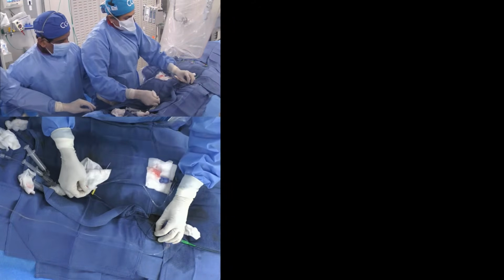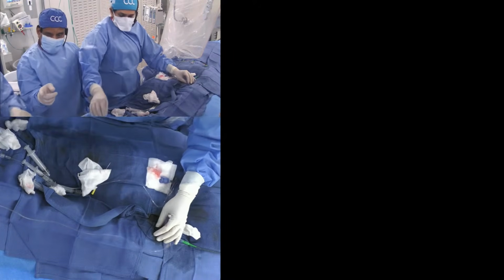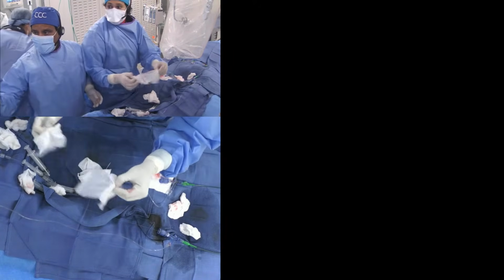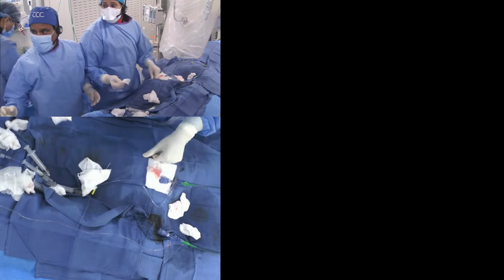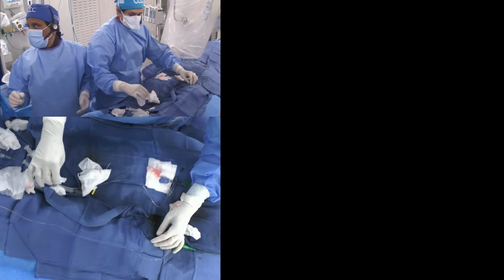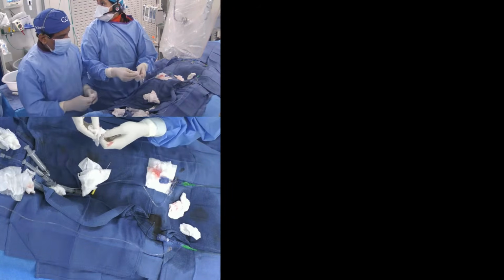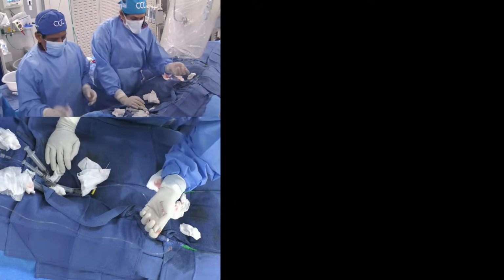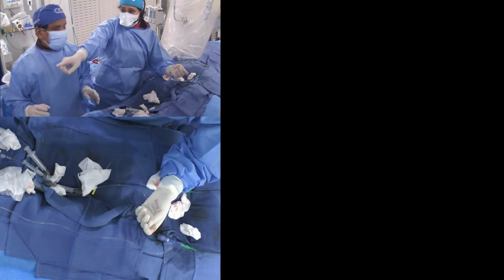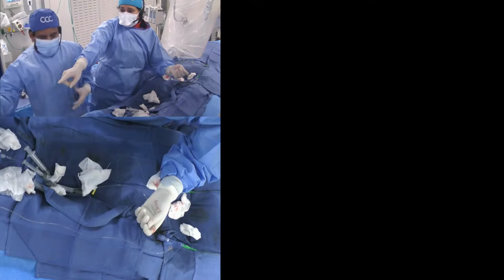Turnpike 150. No, first we have to open with the, what do you have? 1.5 by 8? No, don't, give me 8. 12. Do we have a 2.0 by 8? We need a short balloon. Huh? Yeah, that's fine. High pressure. And 1.5 by 8 you have? Yeah. Okay, let's take this one.